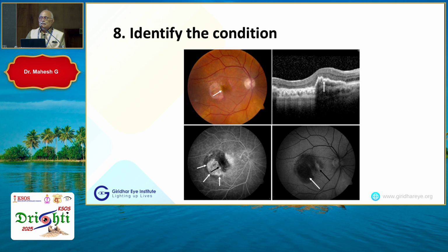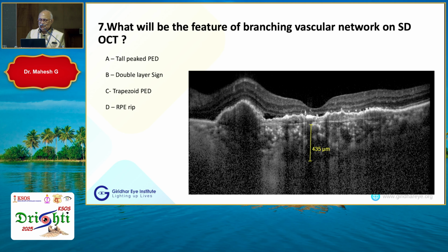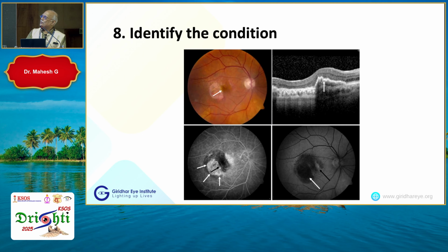Yeah, the clue was in the previous slide actually. It was there in the previous slide. Yeah, yes. Here, RIP was there? No. Clue was there. Okay.